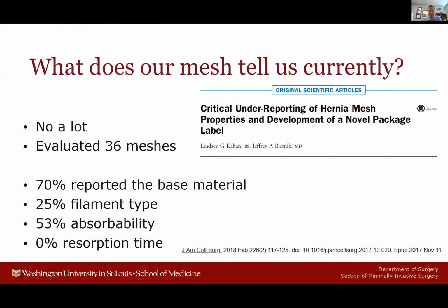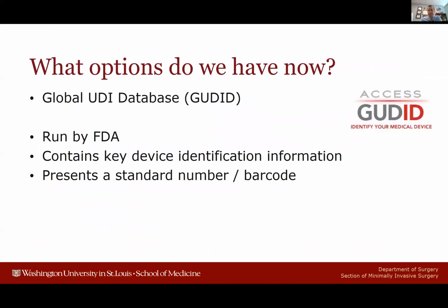It got even less for filament type, whether the mesh was absorbable. And for those meshes that were absorbable, we really had no information on what the resorption time was from one product to the next. So what options do we have now?